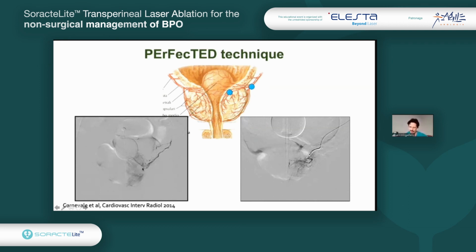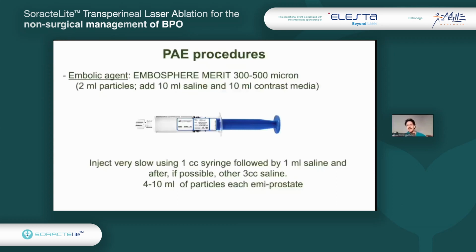They go inside the prostate and embolize the branches of the prostatic artery that go towards the adenoma. So it is a really, really selective procedure. That is the reason they do not have problems with the rectal arteries and vesical branches. The only way to avoid the embolization of other organs is to go very, very distally.